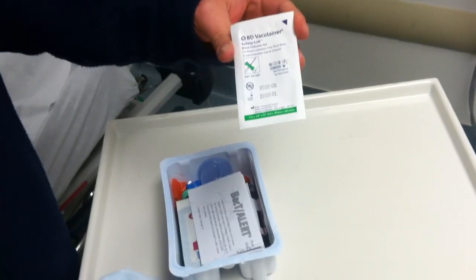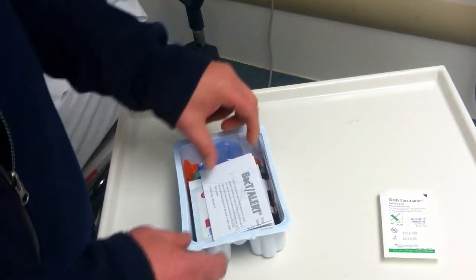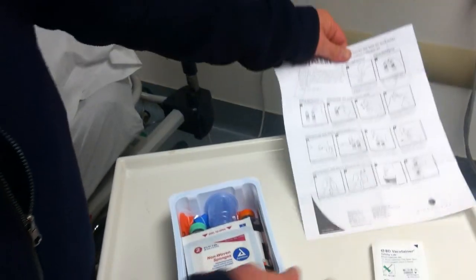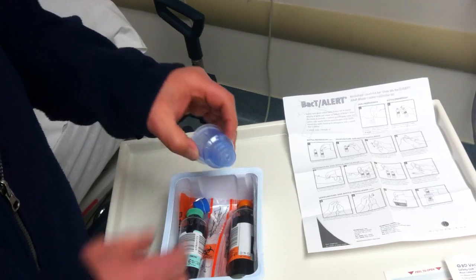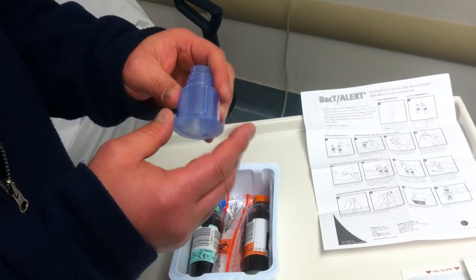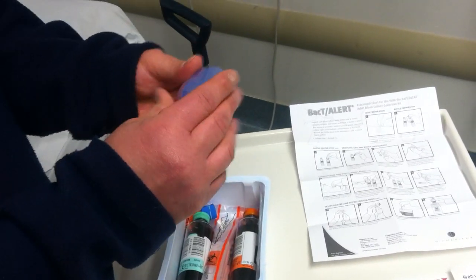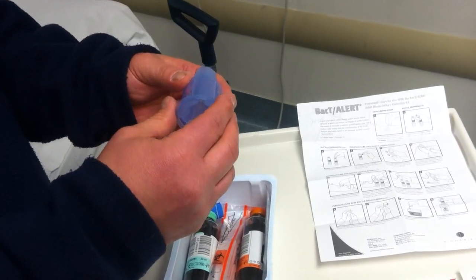We'll find our blood collection set, which is about a 5 — that's a 22 gauge. Here are your instructions if you're not certain. This is your vac container holder, which has an inside adapter. Once you collect your blood cultures, which fit into this adapter, you can slide the sleeve in if you need additional bloods such as a CBC or CMP, and the blood tubes will fit right into this inner adapter.